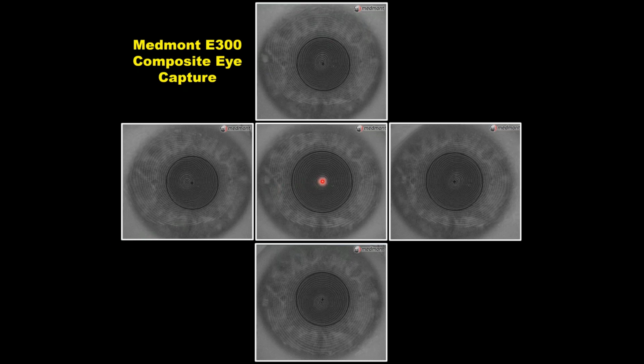What you basically do is have the patient fixate down the axis of the instrument. You take a central image. Have the patient fixate 1, 2, 3, 4 rings, usually 4 rings is optimal, toward the nose, and that will push the placido to the temporal side. Have the patient fixate 4 rings toward the temporal side, and that'll push the placido far to the nasal side. Have the patient fixate down, that pushes the rings to the top.